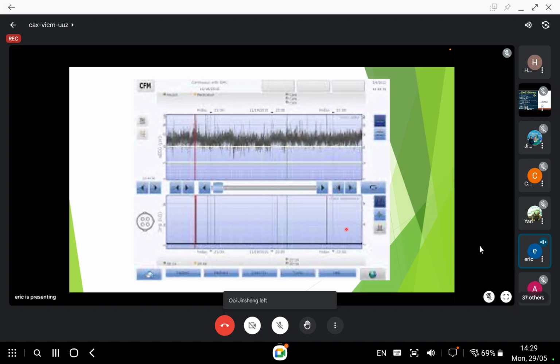But when I document in the case notes, I don't document the impedance, because if the impedance is not correct, then I won't even comment on the waveform. For example, here I would say there is continuous background with sleep-wake cycling and no seizure activity. That's how I document the CFM finding during rounds. Okay. Thank you, Doctor.